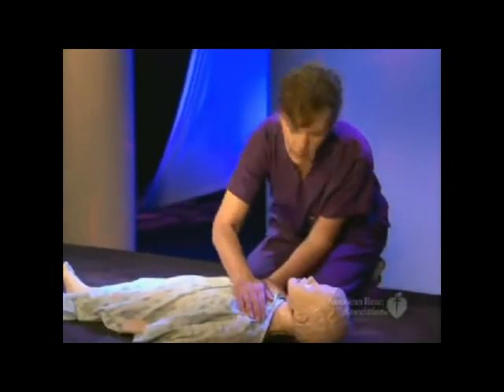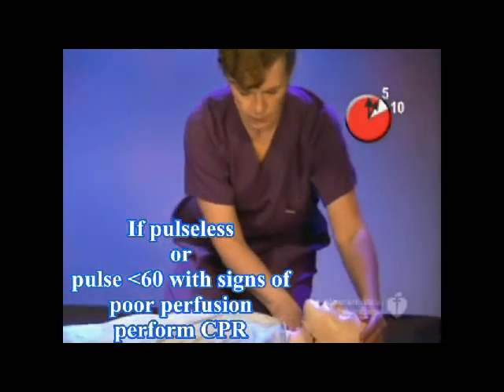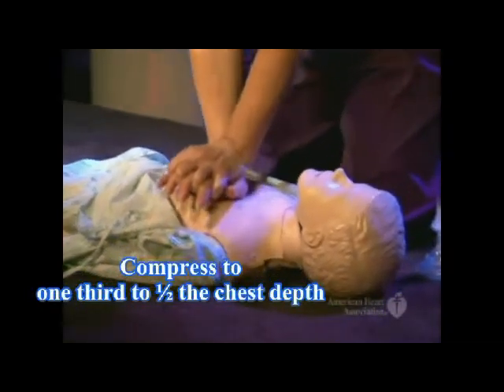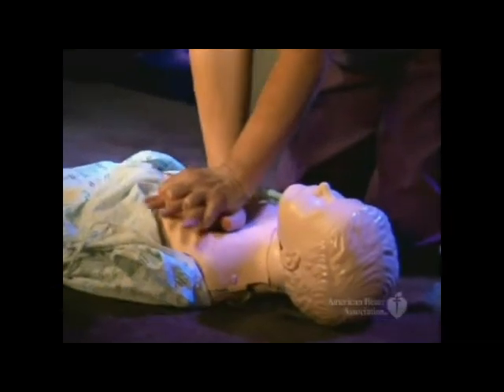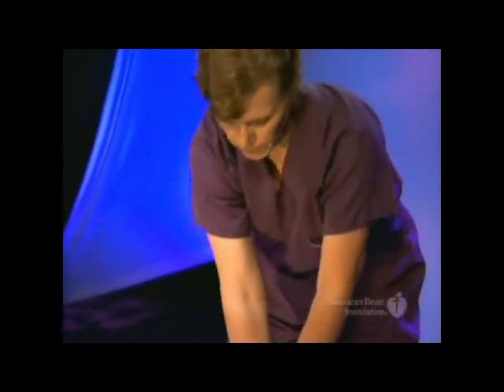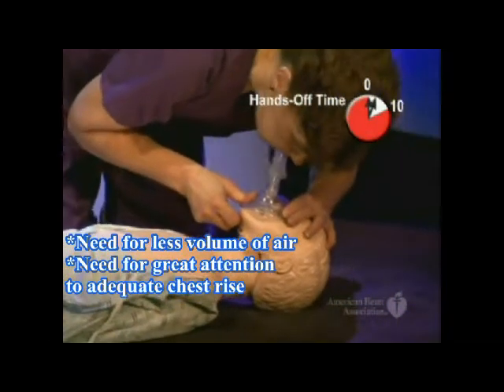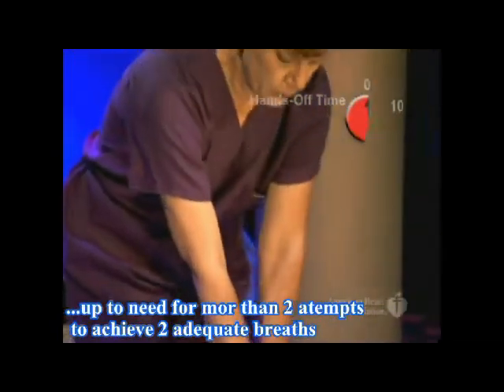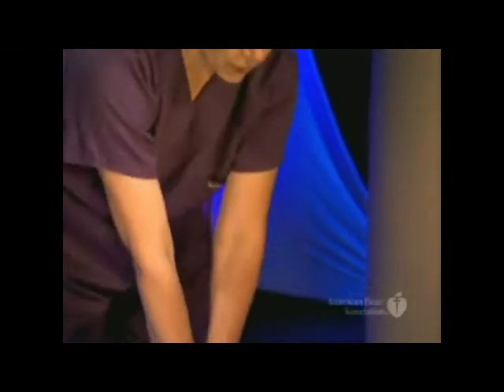Hey, are you okay? You, call a code and get a crash cart. 1, 2, 3, 4, 5, 6, 7, 8, 9, 10, 11, 12, 13, 14, 15, 16, 17, 18, 19, 20, 21, 22, 23, 24, 25, 26, 27, 28, 29, 30. One, 2, 3, 4, 5, 6, 7, 8, 9, 10, 11, 12, 13, 14, 15.